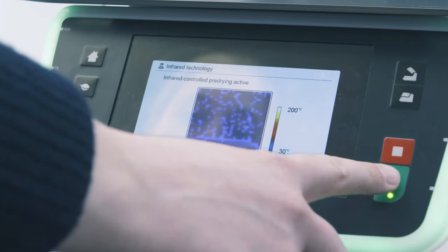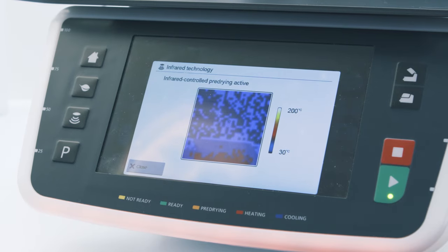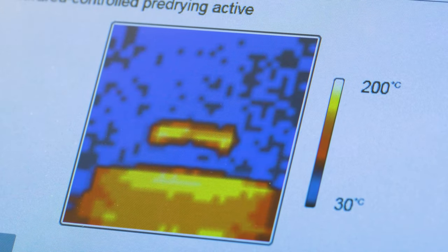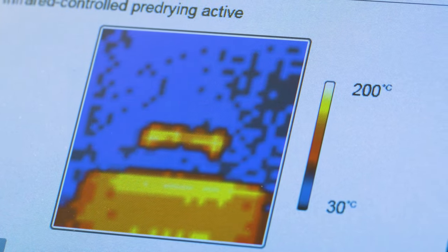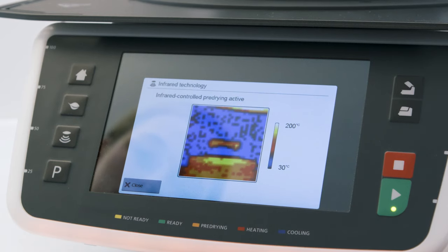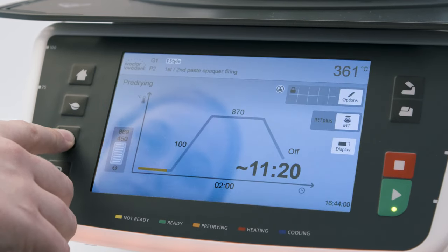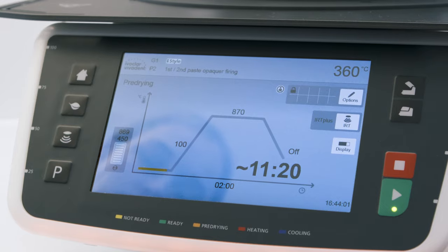With the infrared technology active, the software transmits an image of the object in the firing chamber to the display during the drying and closing process. The IRT key enables you to switch between the thermographic image and the firing curve display.